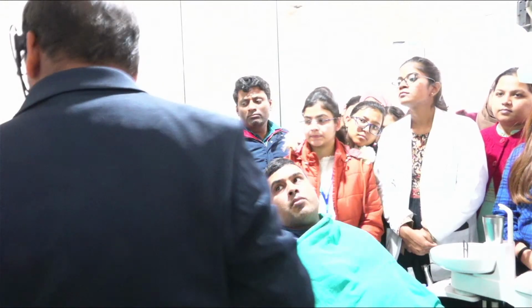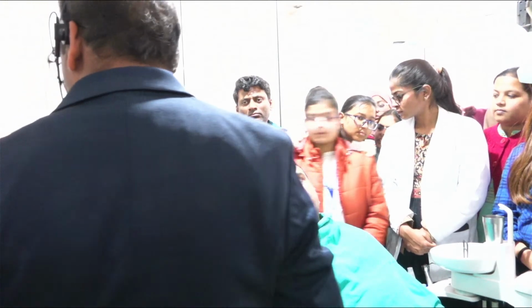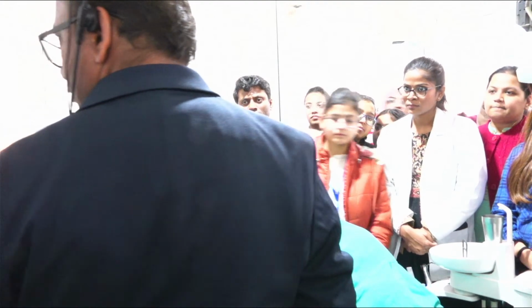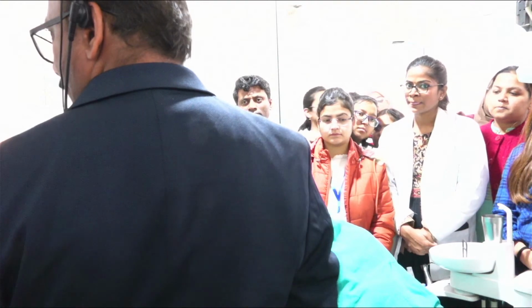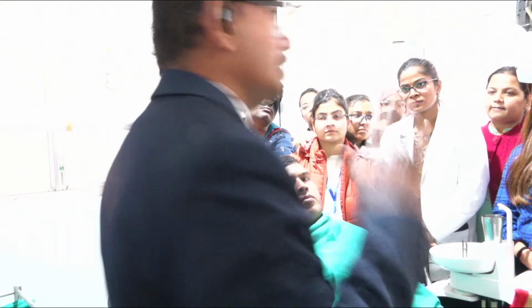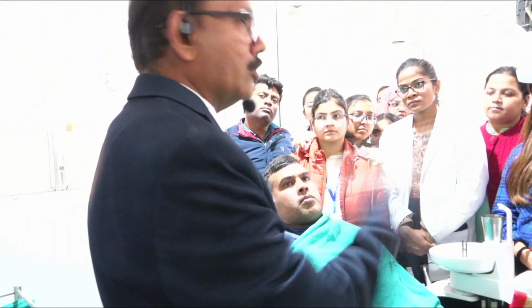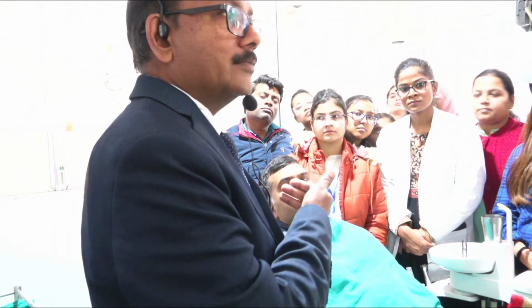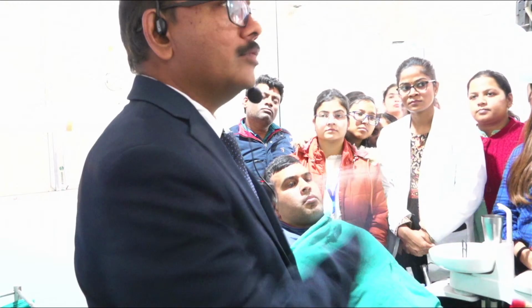So always, if you want to have less now, it will become how much? Yeah, 3 joules, half of 6 joules. So as you start your journey into the laser dentistry, you'll slowly start to analyze how many joules are required, how many are not required. Slowly you understand the knowledge, the science behind using. So 6 joules is what we tell all the patients, because if you want to use this same on the patients, 6 joules again will be little higher. So convert it into 30 seconds.